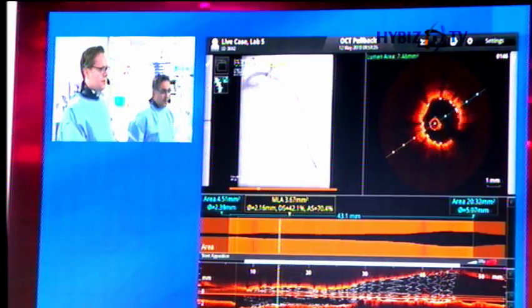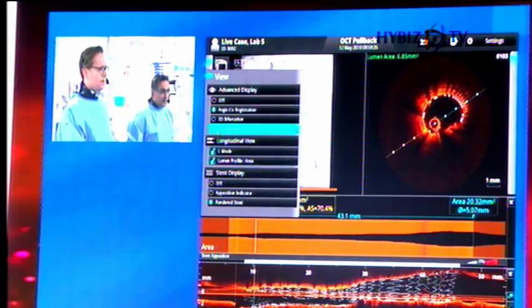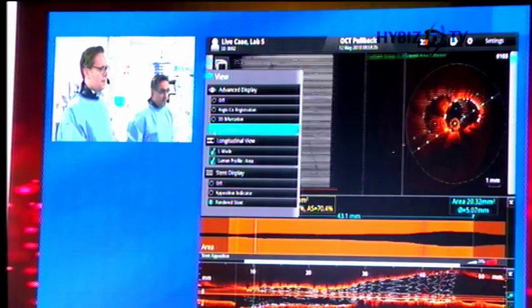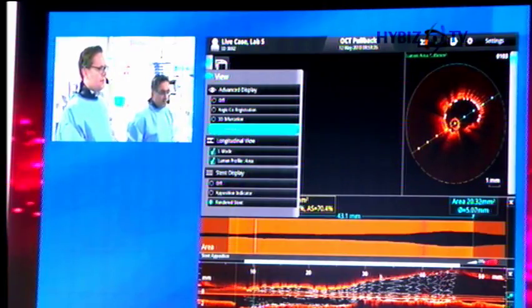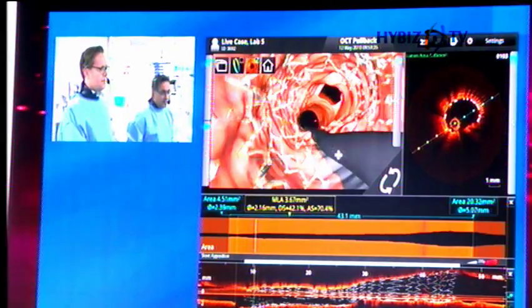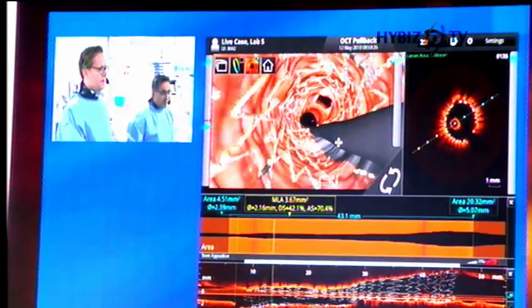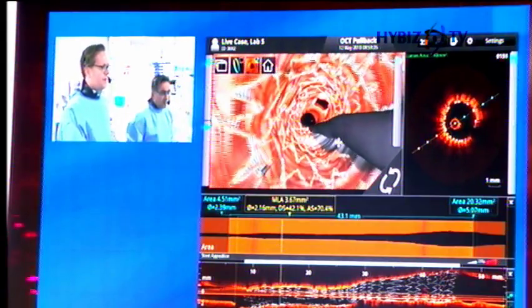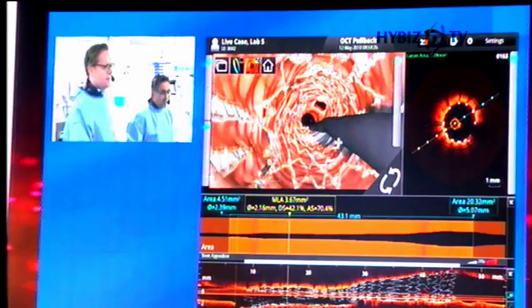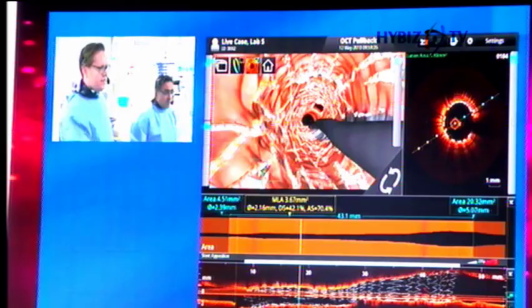Yeah, that's beautiful. And now, Josh, if you just do the fly-through, it lies on top and it'll embed later, which is great, but you don't get the sense that it's dug into the wall the same way as a balloon expandable stent might be, which is, I think, the point of it. So we've got our fly-through here, which is always quite fancy to look at. And if you maybe just do the rendered 3D stent at the bottom and spin it round, just to rotate it round at the bottom.